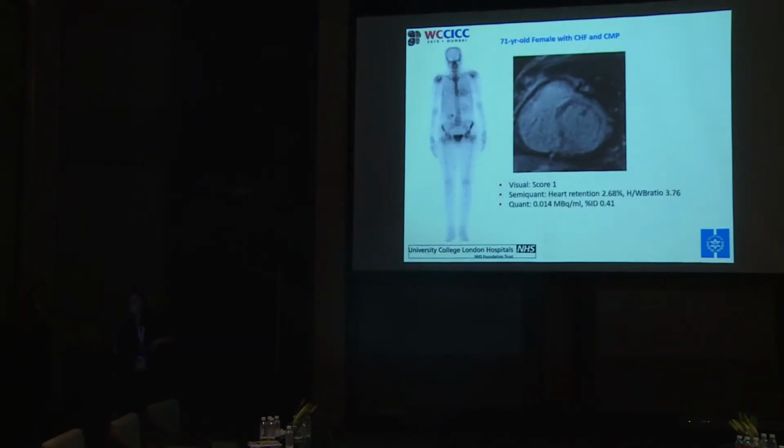Now here is an example of a patient with late gadolinium enhancement, very low activity, so we wouldn't call it positive.